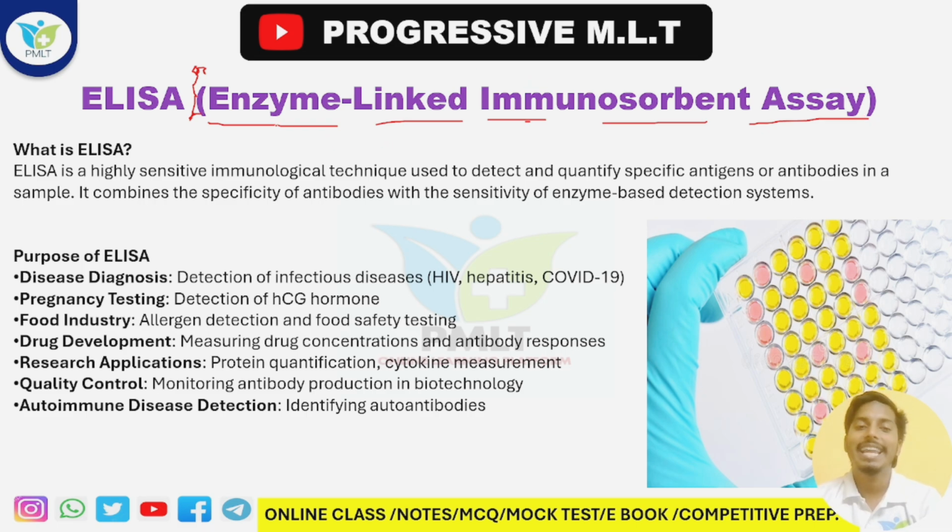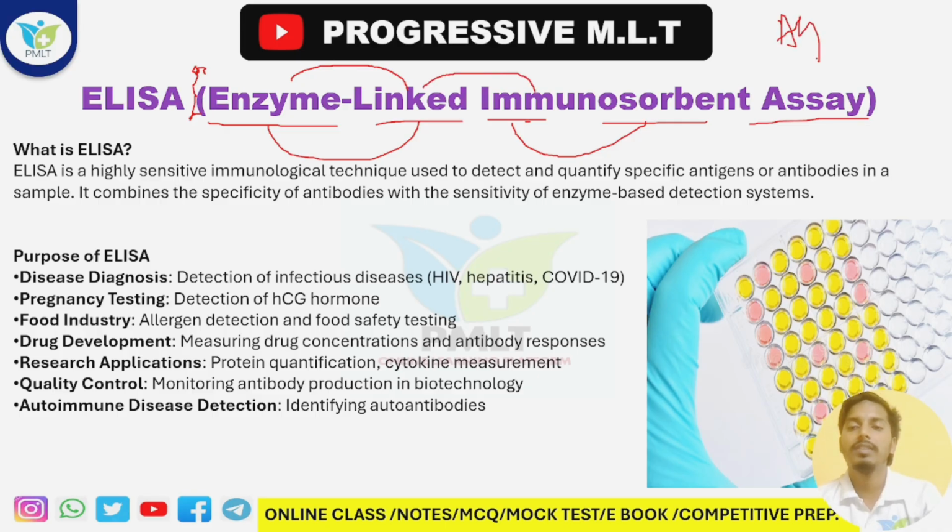Enzyme linked immunosorbent. I'm talking about this again because the answer is here. Enzyme linked means we have to link the enzyme. Immuno defines that there should be an antigen-antibody reaction. Sorbent defines that we use a substrate, and the substrate-enzyme reaction happens. After that, the test basically happens due to this principle.